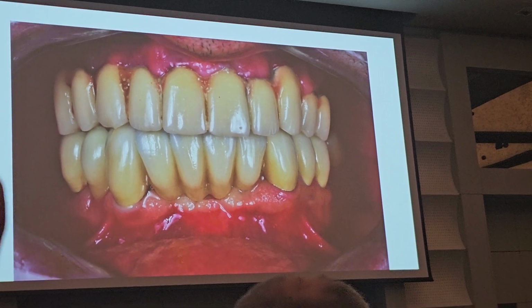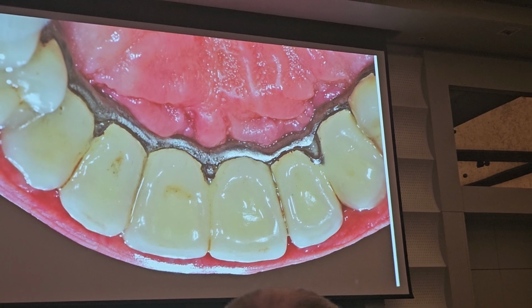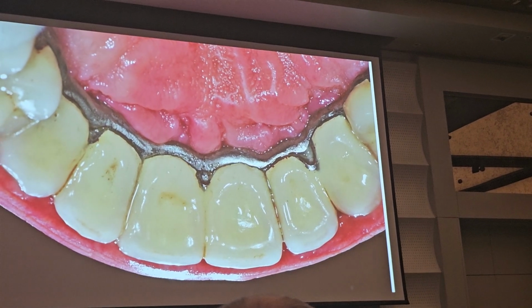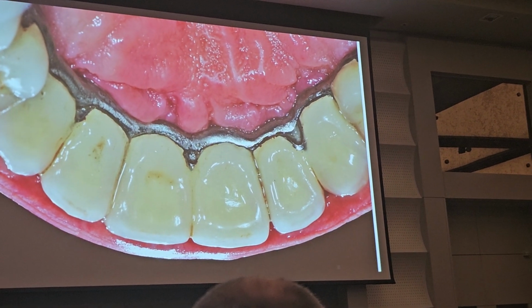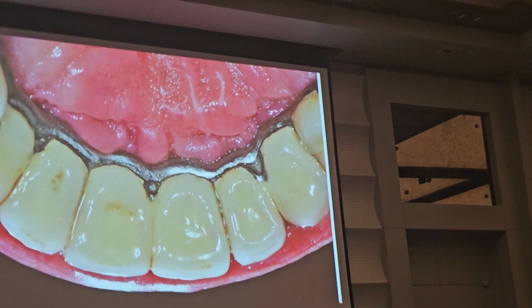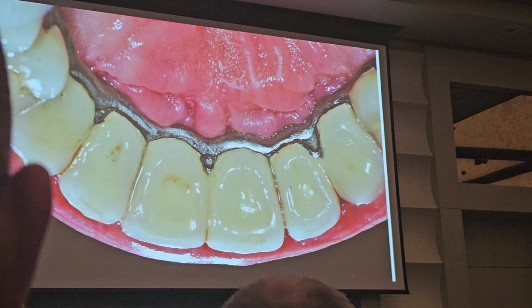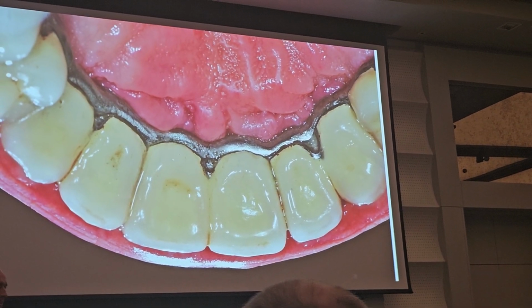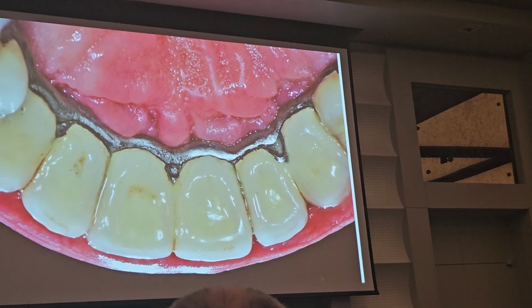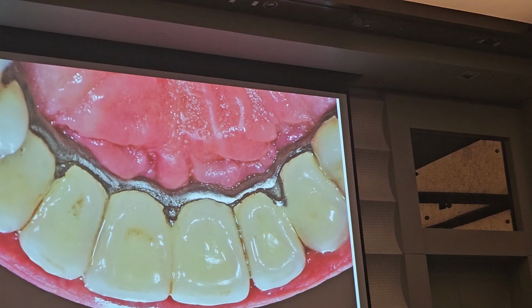But no, it's not the ceramic. The patient cracked the bar, the metal bar in the upper edge. Because when he had single teeth that moved, it was not a problem. But when I cross-linked the teeth and the unit became rigid, all the stress concentrated in the center, and because the bar was thin, because I did all this crown, okay? So I told him, don't worry, because now it's better, because they can move more freely. Patient, it's okay. Because redoing this work will be very expensive, okay?